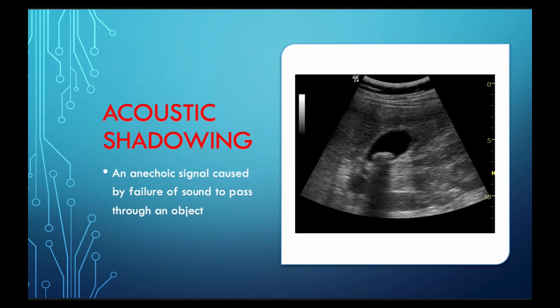Here we see acoustic shadowing — you see a gallbladder with a gallstone inside it. You see the shadow distal to the gallstone, which is that anechoic area below the stone, basically because the sound waves are unable to pass through the calculus structure. This is a helpful hint when locating and identifying gallstones in the gallbladder as opposed to polyps or other things. It's also helpful to identify ribs and rib spaces and identify the spine shadow when doing an aorta ultrasound.